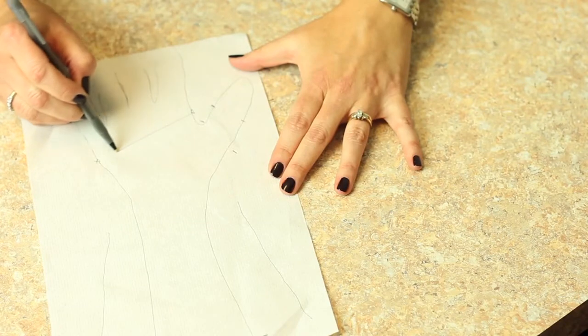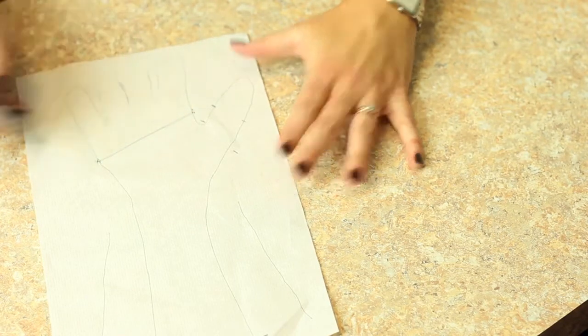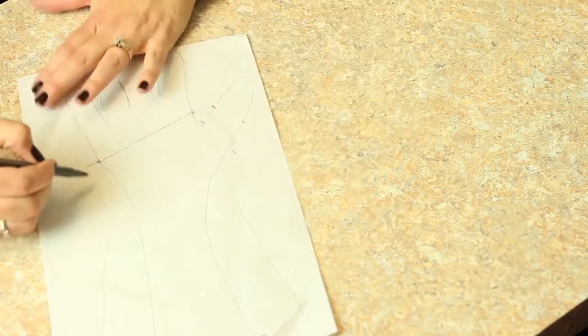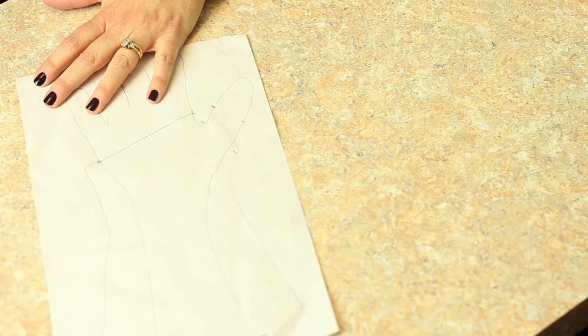The distal palmar crease I'm just going to connect those two areas. I'm going to come out on the ulnar side a little bit just to be able to have some troughing on the ulnar side of the hand and then connect it down proximally.